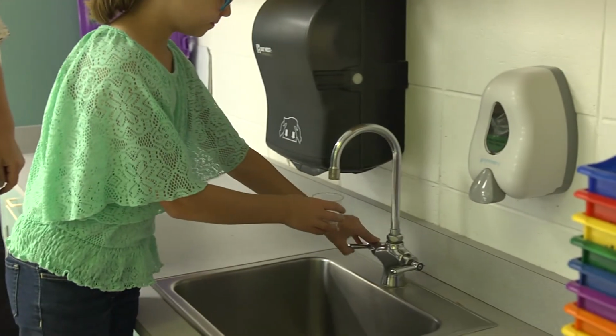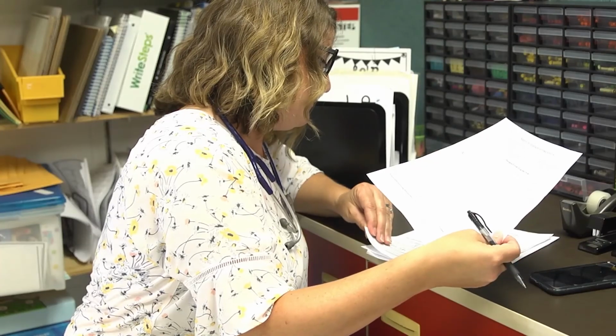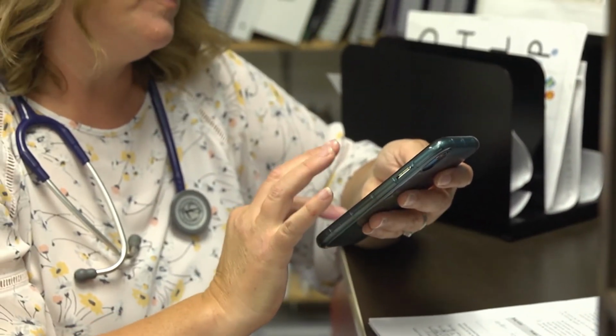Instructions for post-medication administration with and without spacer. Have student rinse out their mouth with water and spit as needed. Wash hands. Document medication administration in student's medication administration log. Follow up as needed with parents or guardian and healthcare provider.